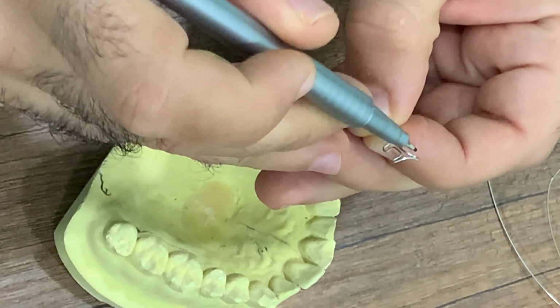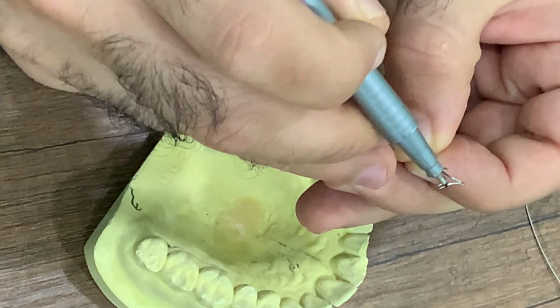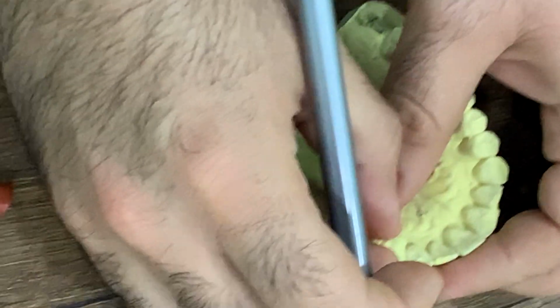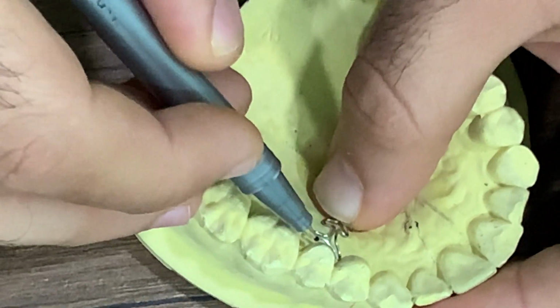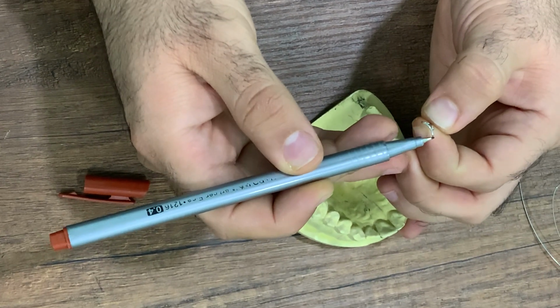Starting with the active component. This is the active component. The active component of T-spring is the horizontal arm, parallel to the occlusal plane of the tooth and located at the occlusal end of the tooth to be moved. It is curved. Why is it curved?